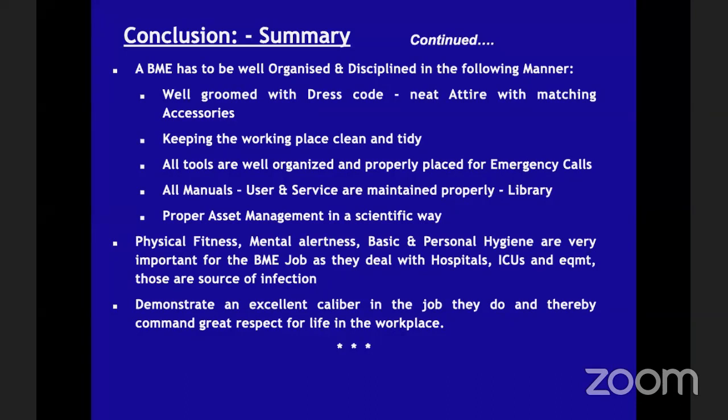So what he has to do, he has to open and inspect the machine, check the performance of the machine before delivering it to any of the departments. Physical fitness is very important. Mental alertness is very important. He should have his antennas strong, mental, physical, ear, eye, everything, so that he should be able to diagnose. Logbook he has to maintain, which I have not mentioned here. Whatever he does every day, he should write it in the logbook.